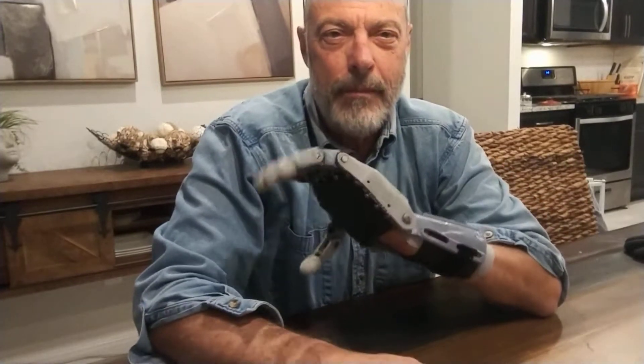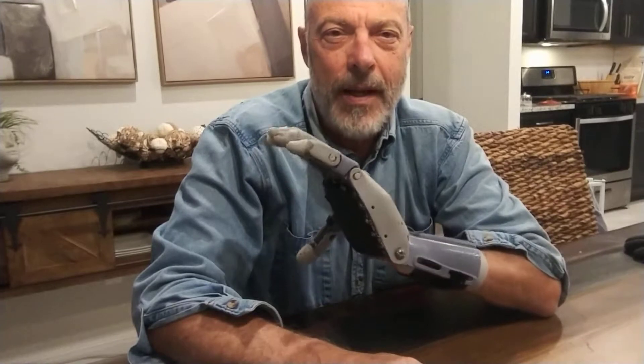Hi, this is Mike, a volunteer with Enable. Enable is a worldwide group of volunteers that make 3D printed prosthetic hands for kids and all kinds of people that have some kind of a disability with their hand. It's mechanical, it's wrist operated, and there are people around the world that are making these to help people out.